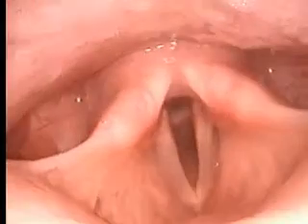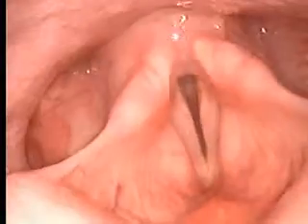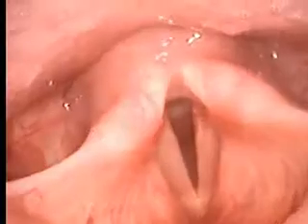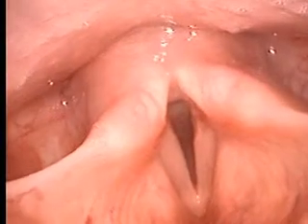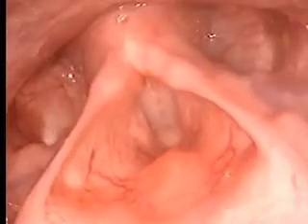The laryngoscope should not be passed through the vocal cords, since contact can elicit laryngospasm. Ask the patient to sniff or to inspire deeply through the nose. This causes maximal abduction of the cords, permitting optimal assessment of this important area. Ask the patient to say "ee" or "ah."